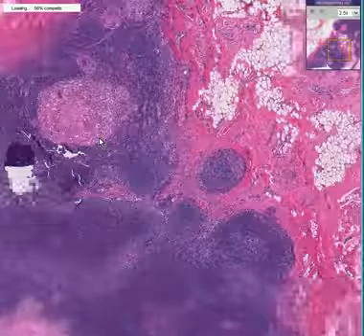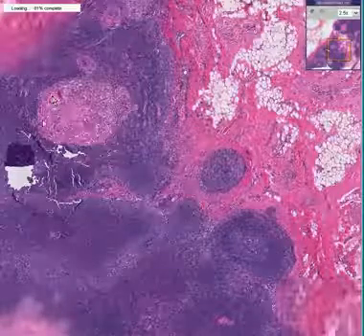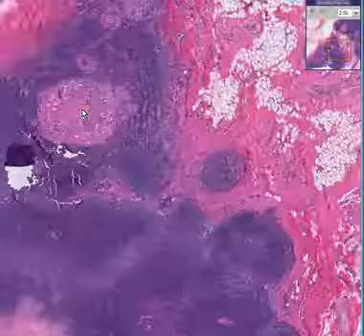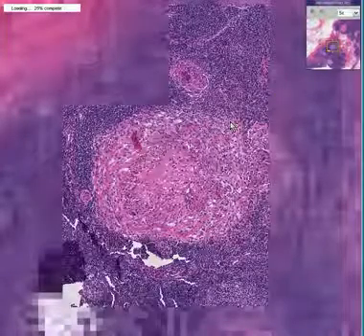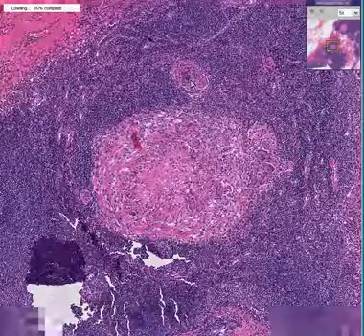And here are generally the histiocytes. You can see there's some fibrous tissue in here as well. And I'm going to zoom it up a little bit. And you could see giant cells, can't you? Even at this stage, you could see them here. You could see them here.